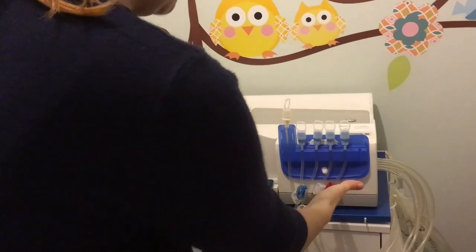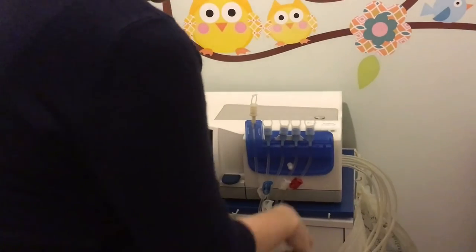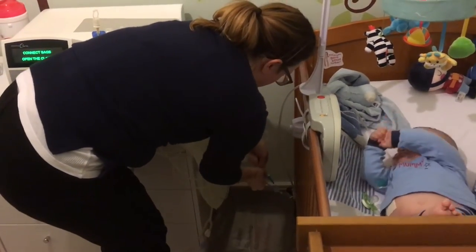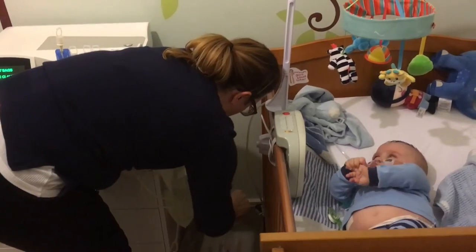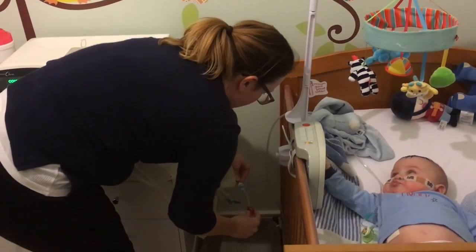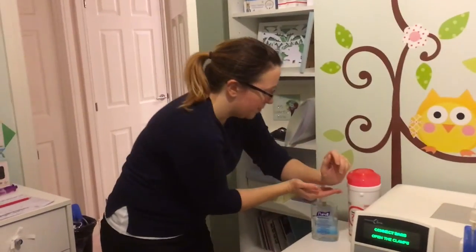Another two-minute hand wash and more gel, and now we're connecting the bags as the machine says. The red clamp goes first — that's the bag going on the heater, so red for hot. I'm not going to talk much while I take the tops off because there's an infection risk and we don't want to touch the bag opening. That's the bag attached; I break the seal and open the clamp.